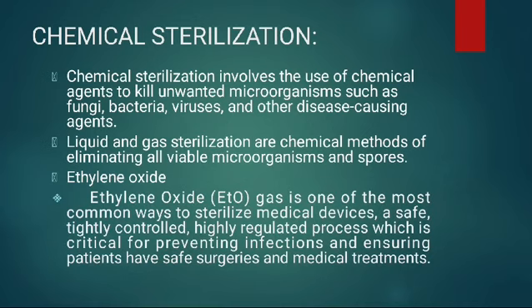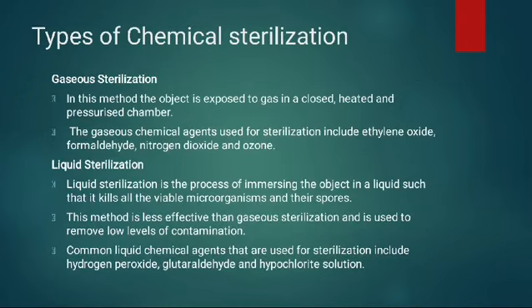Chemical sterilization involves the use of chemical agents to kill unwanted microorganisms such as fungi, bacteria, viruses, and other disease causing agents. Liquid and gas sterilizations are chemical methods of eliminating all viable microorganisms and spores. Ethylene oxide gas is one of the most common ways to sterilize medical devices. A safe, tightly controlled, highly regulated process, it is critical for preventing infections and ensuring patients have safe surgeries and medical treatments.